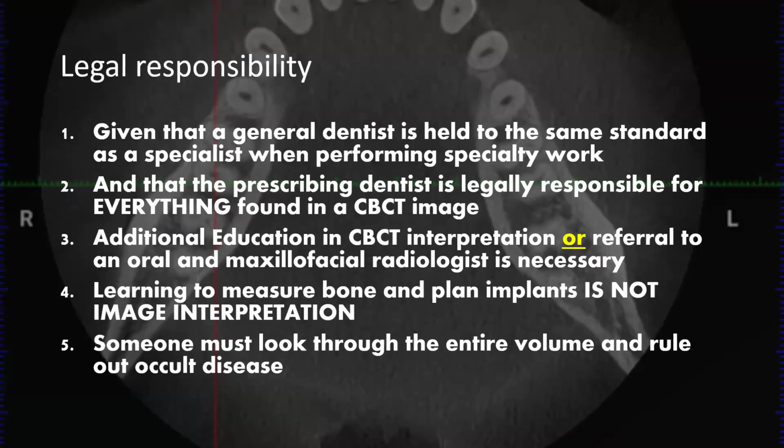One thing I also recommend is looking at medical CT books, medical CT anatomy. If you can recognize that anatomy, it's going to be really similar on cone beam CT, but actually we see a bit less on cone beam CT. In medical CT, they can actually see the white and gray matter differentiation in the brain, which we don't see. But most of that still applies to us.